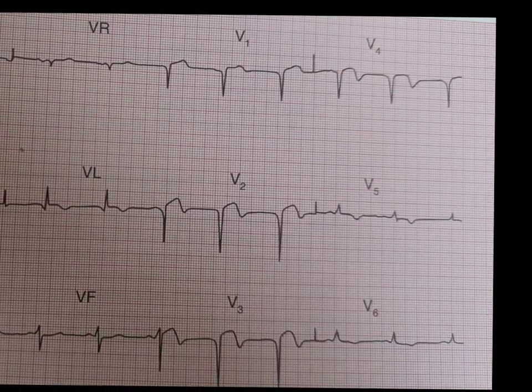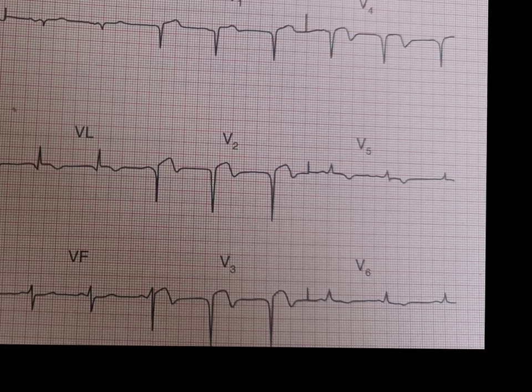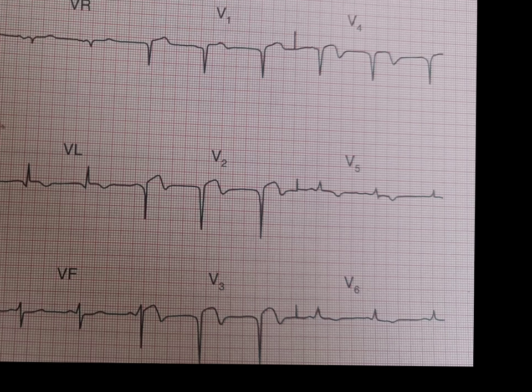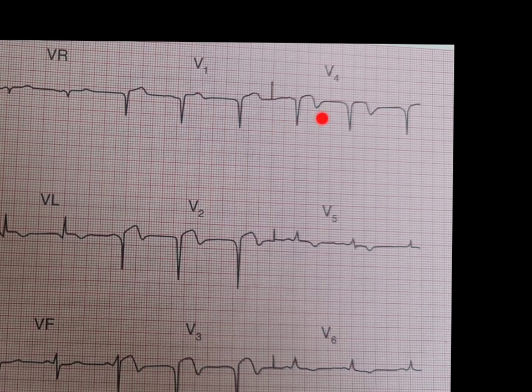In leads V2, V3, and V4, we have ST elevations — proper ST elevations. Also, you can see T wave inversions as well in V2, V3, and V4.